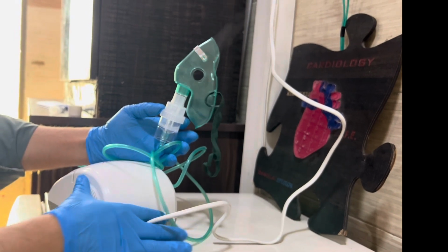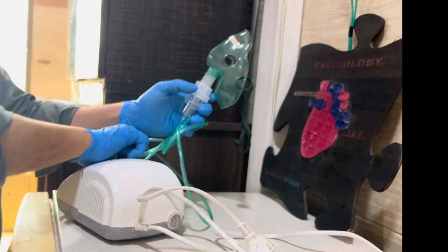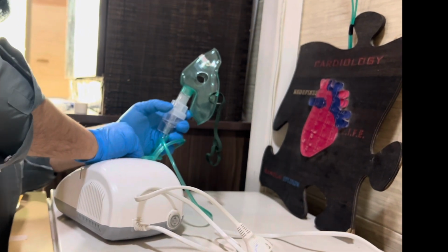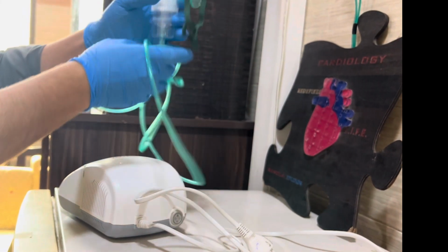Then it will work in your respiratory tract to help bring the sputum out. It's very important in respiratory infection, especially when you have sputum.